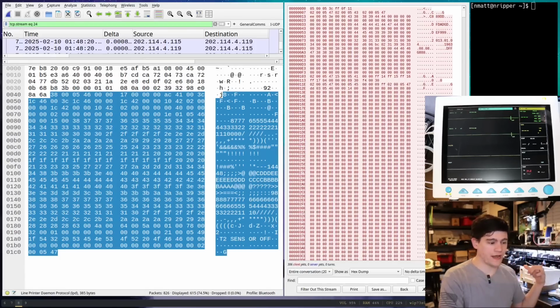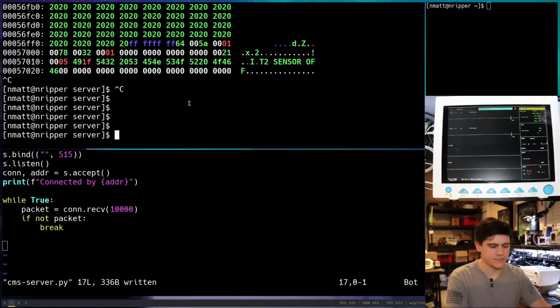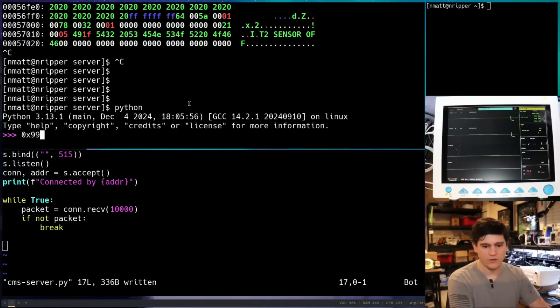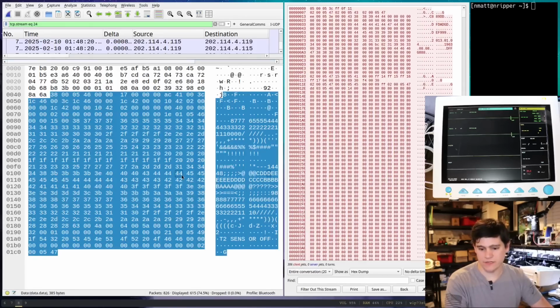And so we found that value 99, right? So we know there was a 99 reading somewhere. So if we come over here and stop that server, let's just open Python. And what is 99 in hex? It's 63. All right, so now we can start to look through here for a 63 byte. And I kind of know where to look, and I need to find it.